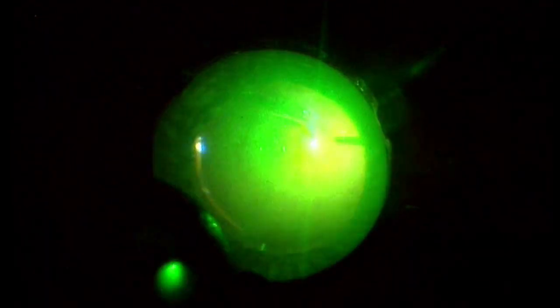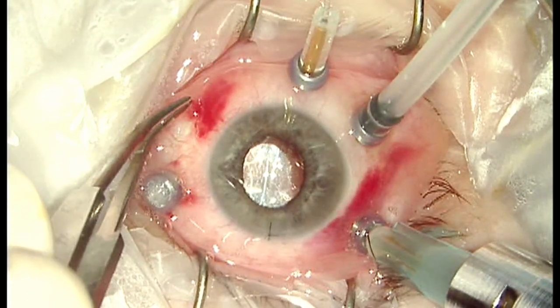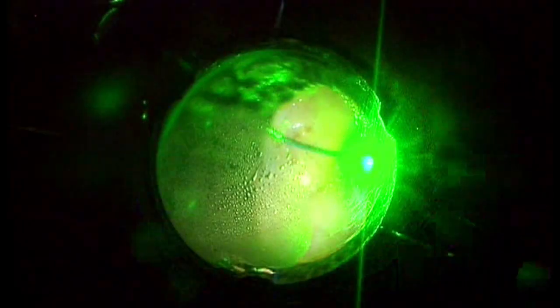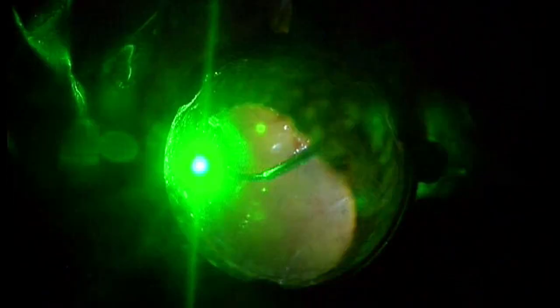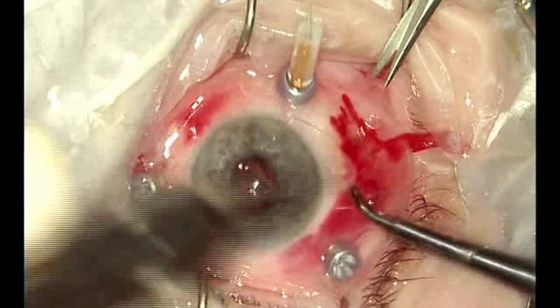Panretinal photocoagulation is carried out until the ora serrata, and silicone oil is finally injected into the vitreous cavity. More laser is applied to complete the PRP under silicone oil. Some residual fluid is removed from an iatrogenic tear on the nasal retina under silicone oil. All sclerotomies are sutured.